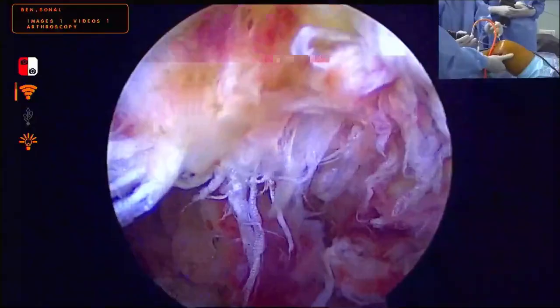This is one. And this is the other one. So leave it, please. So hold this one too. So now what I am doing is I want to repair the PCL now onto its place. So this is how I am doing it. So these are all suture anchors and very thin small threads. So we'll be just putting them one by one into its place. So this is an extended indication of osteonaut X anchor.